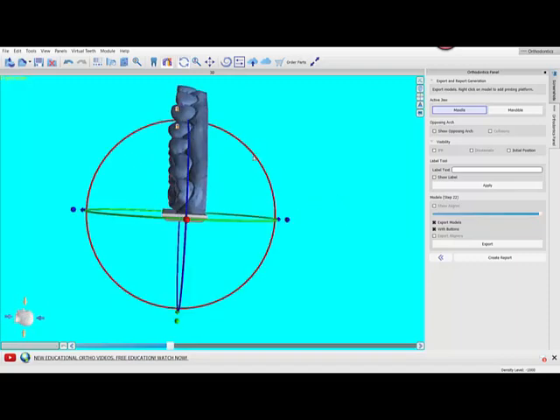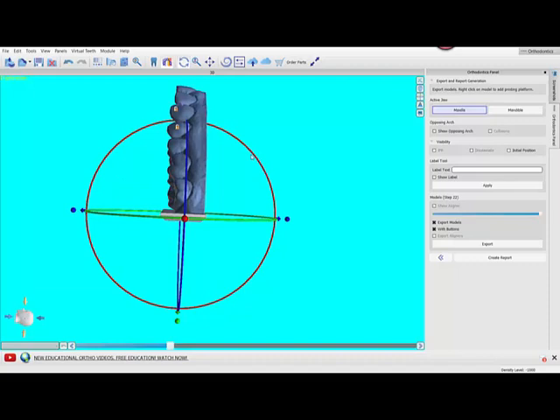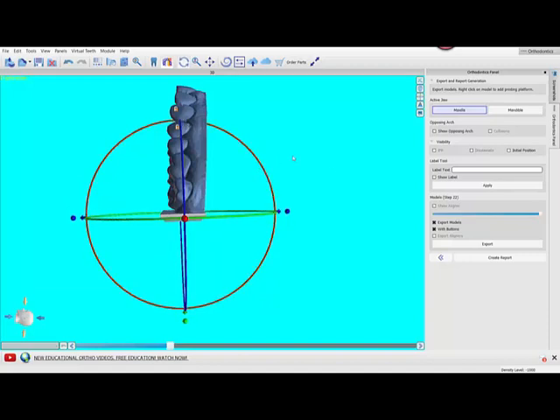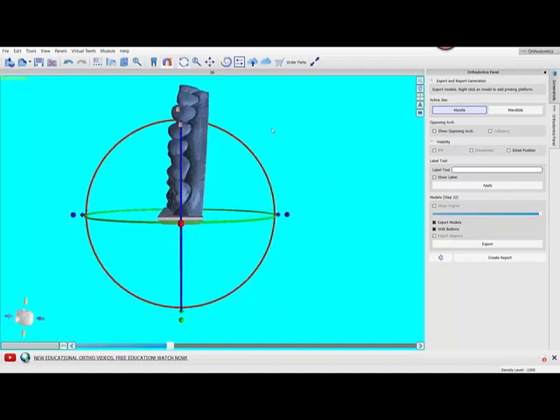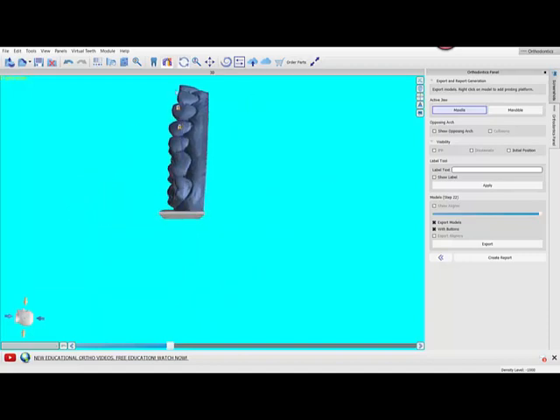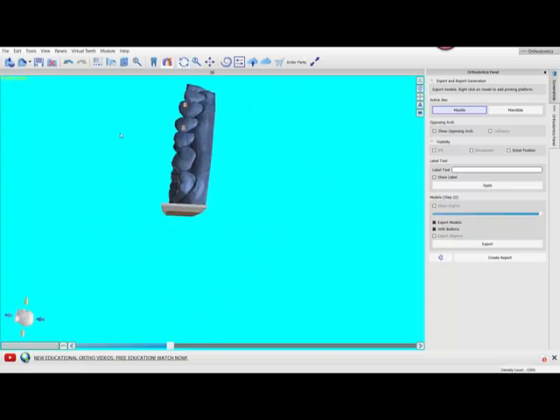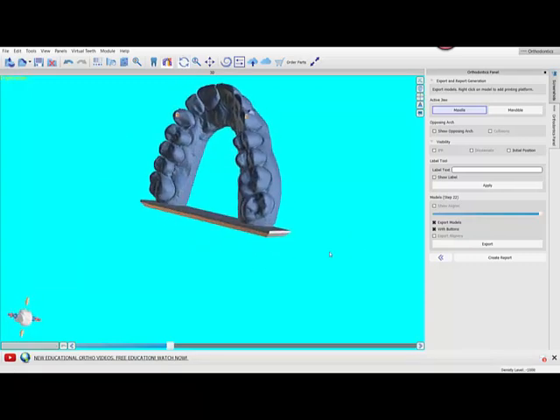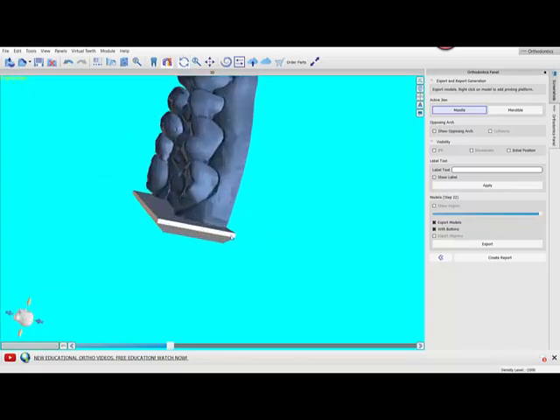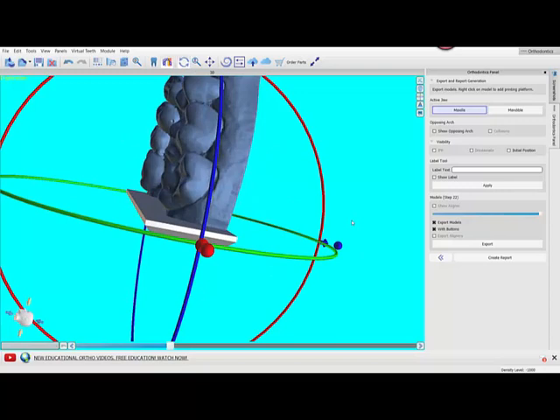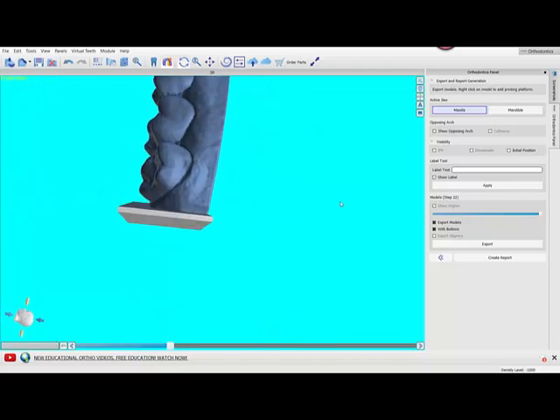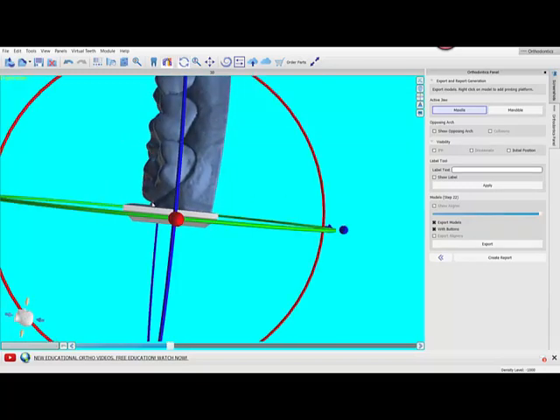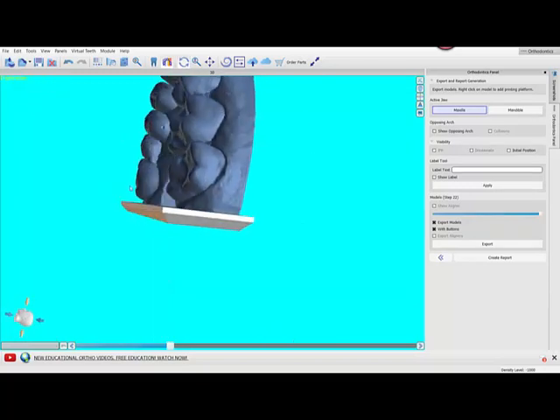In a case like that, I will take this and tip it this way—tip the occlusal aspect of the platform distally, tipping it away so that when it prints it's printing like this and the teeth are essentially more proclined by doing that.